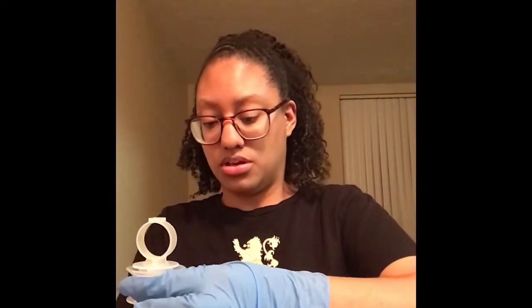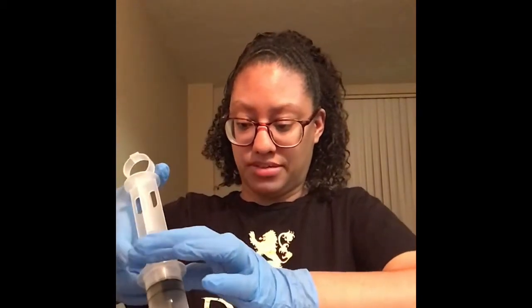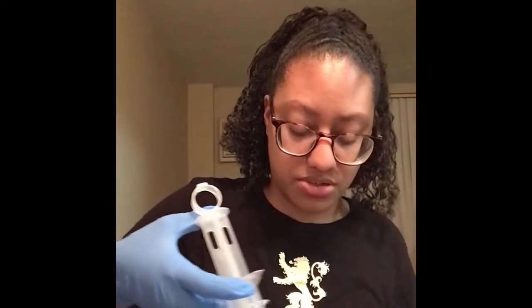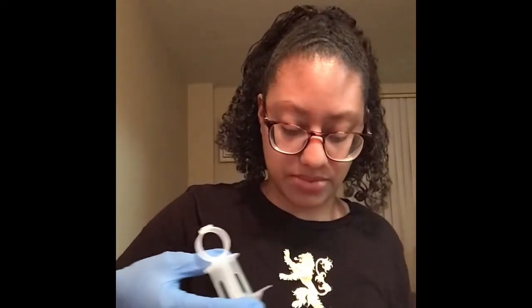So now that that's done, we're going to hold our syringe, making sure we don't touch the inner part that goes into the bottle. We're going to pull back, get our solution, and we're going to irrigate the wound top to bottom. If our order says until clear, we're going to make sure that we do it until the solution runs clear.